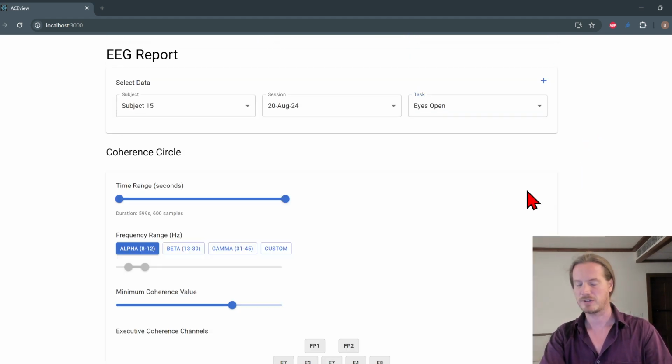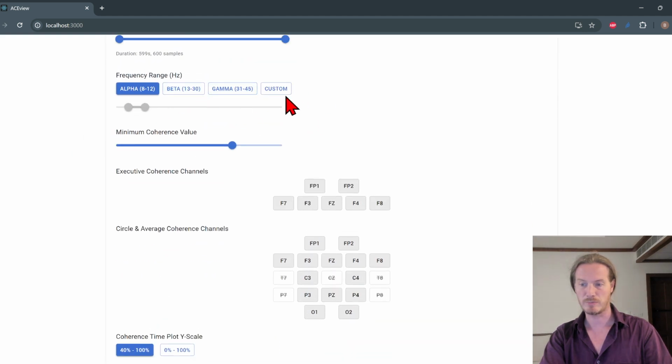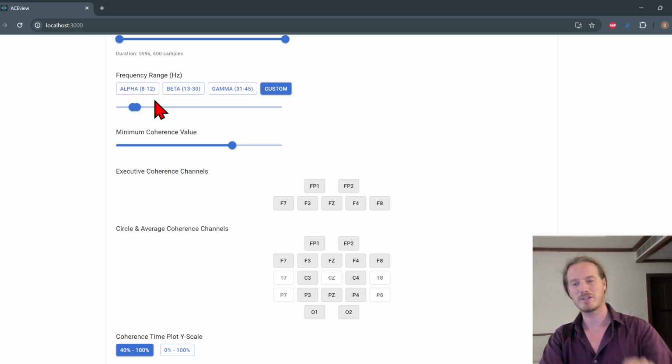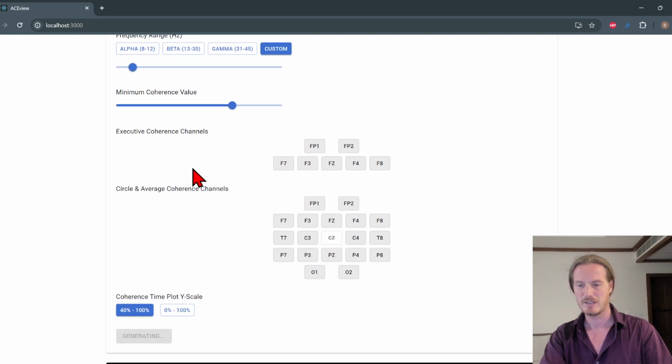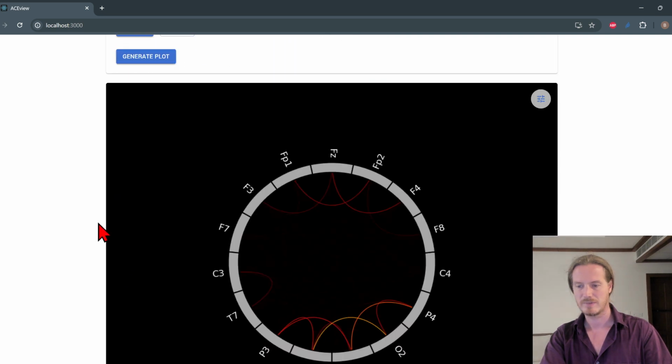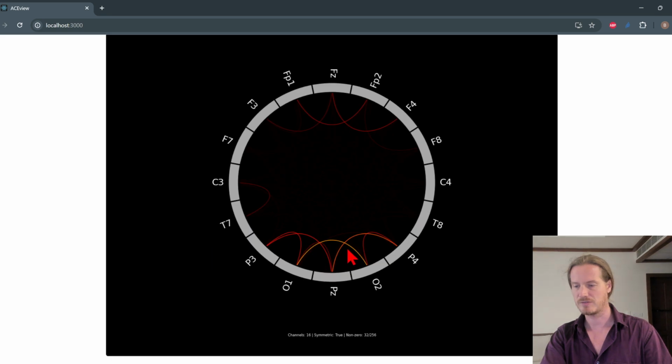If we click the settings button here, then we can change, you know, if we want to see alpha, beta, gamma, or we want to see a custom range. Maybe this person specifically has a peak at 9 Hertz. So we're going to go to 9 Hertz and really specify that. And instead of seeing the normal channels that we have in the circle, we also want to see some additional channels, which I usually switch off. So now it's generating, and this is what it looks like. Oh, it's just still adding a few extra channels.